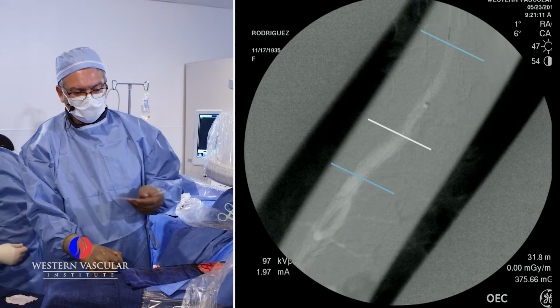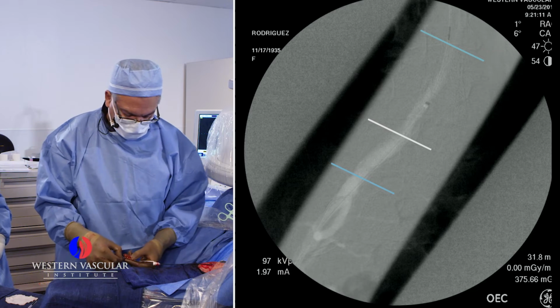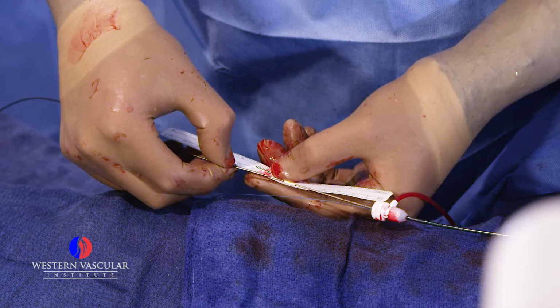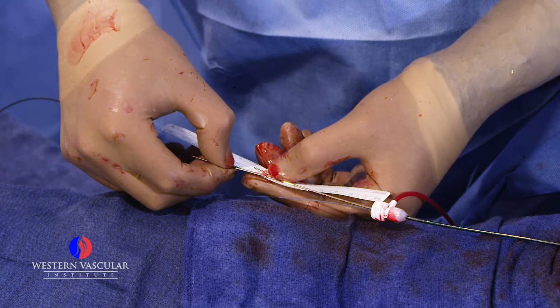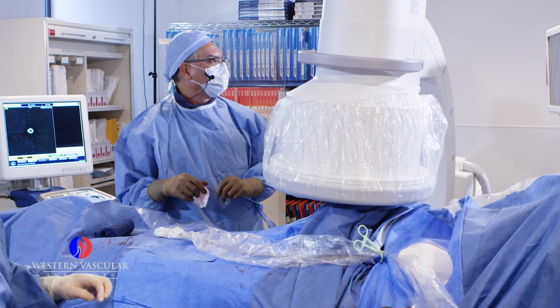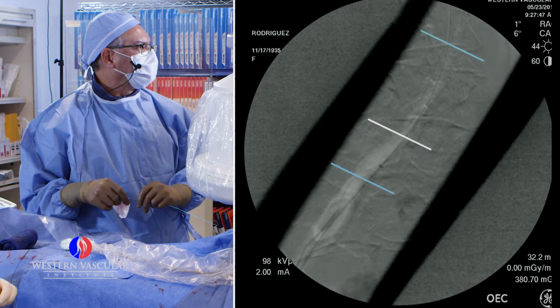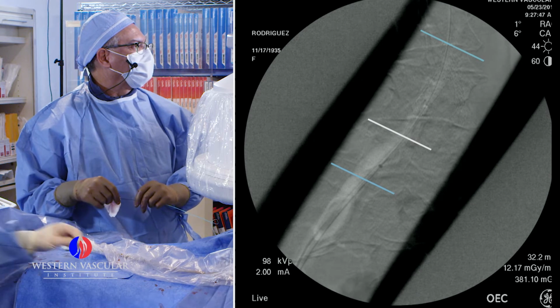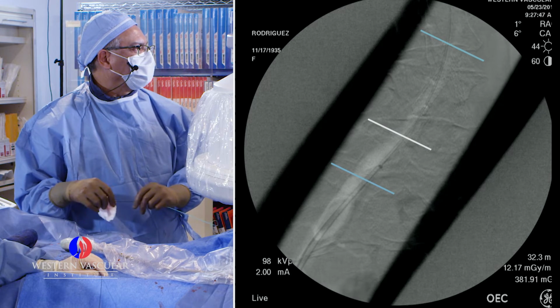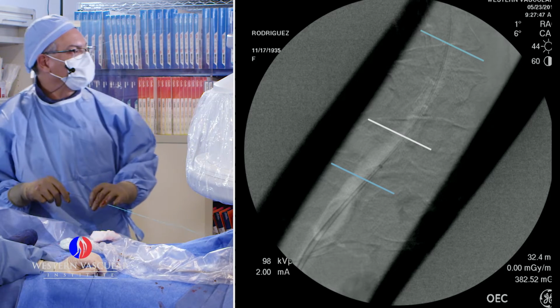With this ruler, we're going to measure the length of the catheter that I pulled back. And based on this length, the stent has to be 10 centimeters. So because the stent that we're using is quite big, what I will do is coming from below with the wire. Now that the vessel is open, you see how easy the wire now crossed. At the beginning, we couldn't come from below, but now the wire went through easy because it's completely open.